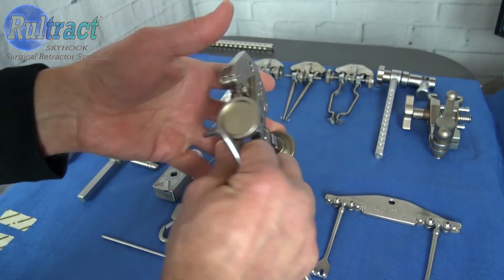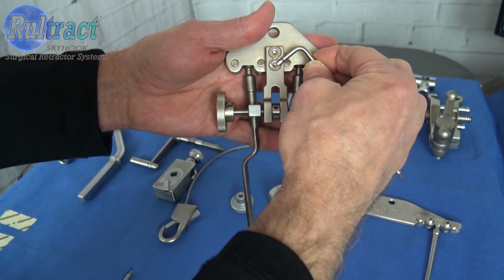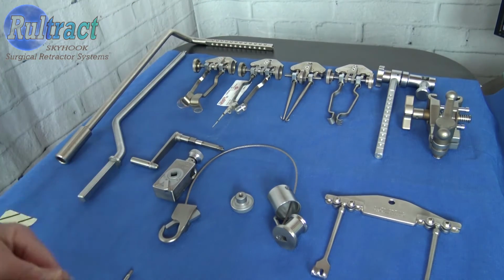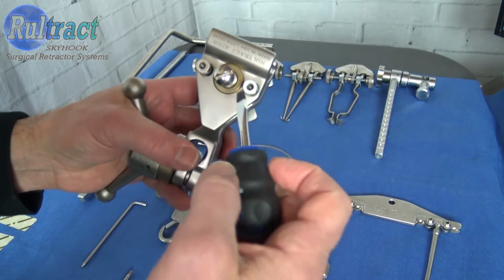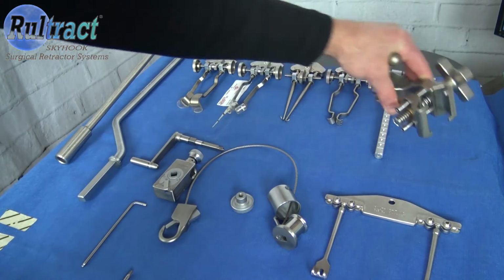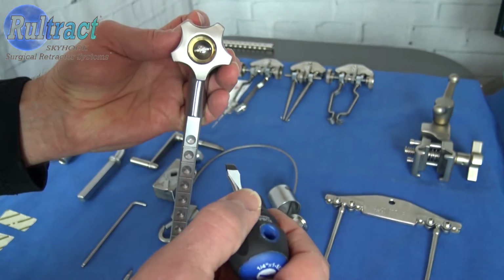Also on the resternotomy retractor, you'll want to turn it over, take your small Allen wrench, and check both of these screws for tightness as well. Do that for all 4 of the resternotomy retractors. Then you'll want to check the tightness of the screws that hold your clamp handles on, and then the screw that holds the knob on your rotating extender bar.